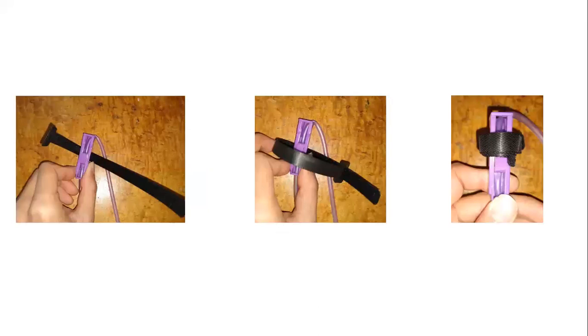There were two things that were tested here. One of them was ease of use, to see how quickly someone could implement this if given the task. I asked 6 individuals to try this 5 times each. Remember that one of the specifications for this task was to take under 10 seconds on average.